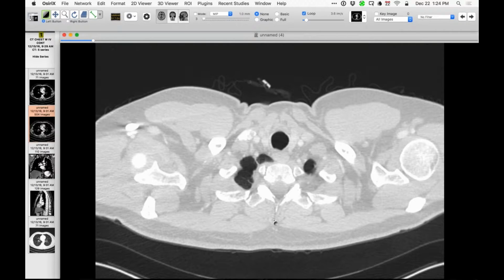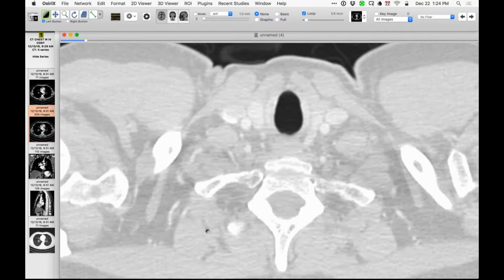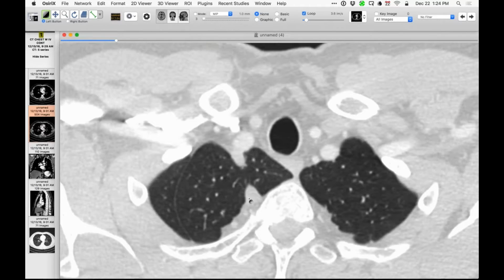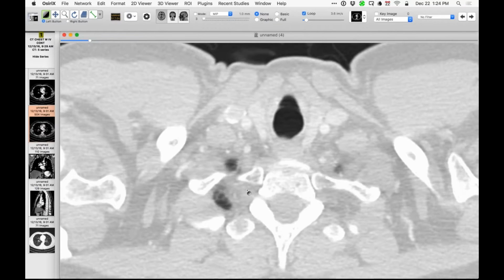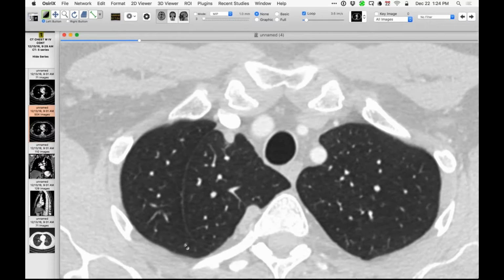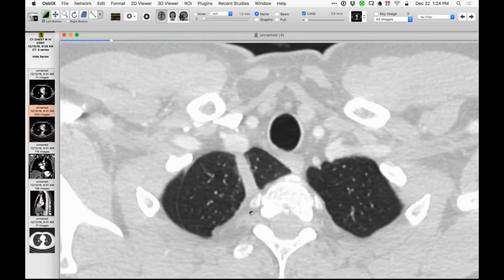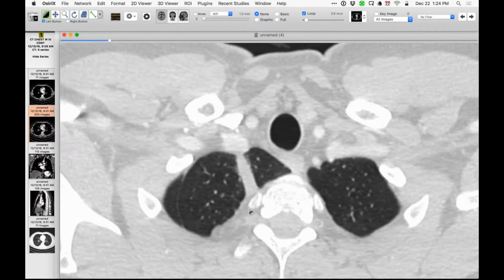There's another fissure. So it's an accessory azygos fissure. Yeah. So there's a little fissure type structure right up top here. Yeah. And then there's the azygos, and there's the other fissure. Very interesting. Yeah, I'm not sure how to classify this exactly, whether it popped out or it's just one of these. This is an anomaly. You can find reports, yeah, it's funny. You can find reports of an accessory fissure here, described just as an accessory fissure, and where you have even the right brachiocephalic vein can be intrapulmonary or seemingly intrapulmonary. So variations on that theme have been described, and I'm not quite sure what to make of this.